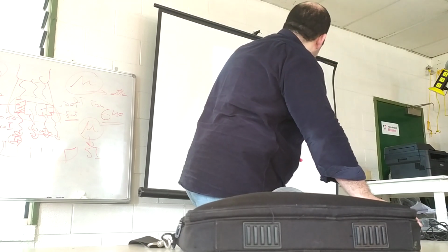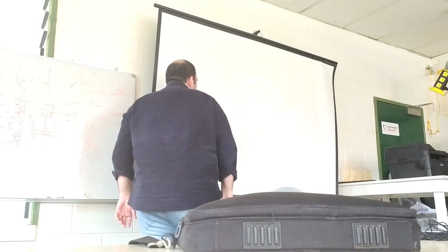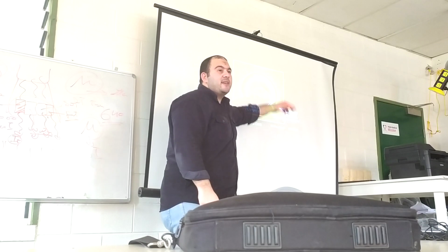For fourth generation, the detectors are fixed or stationary, and only the X-ray tube rotates around the patient, but it's very costly, very expensive.